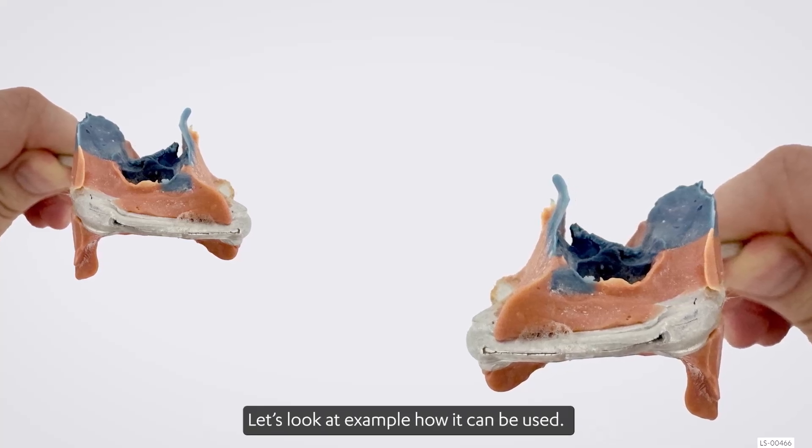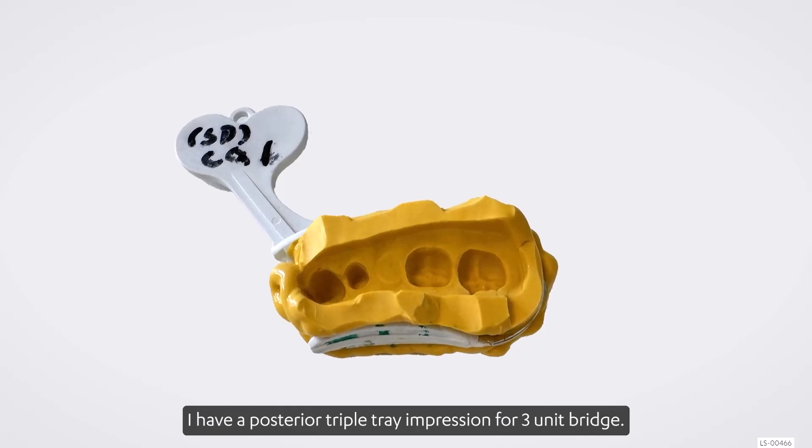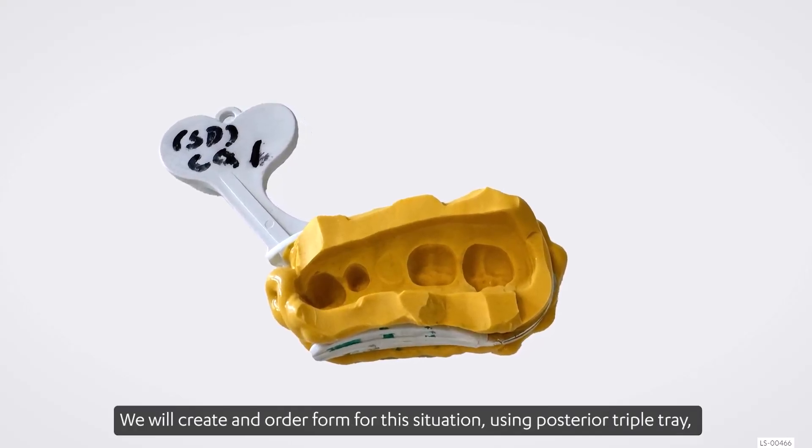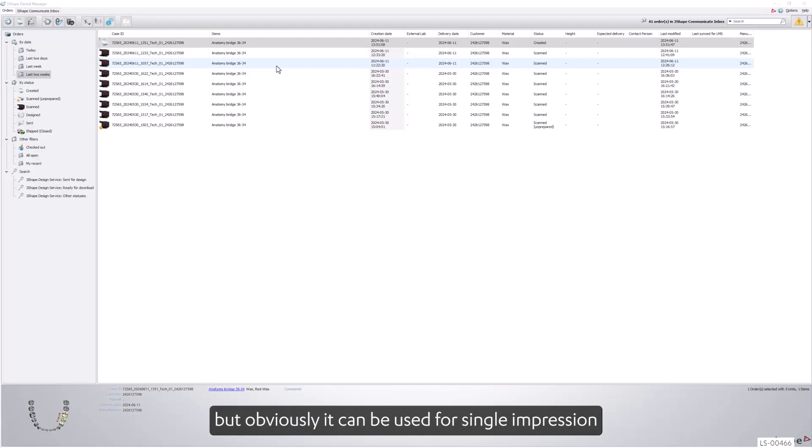Let's look at an example of how it can be used. I have a posterior triple tray impression for a three-unit bridge. We will create an order form for this situation using a posterior triple tray, but obviously it can be used for single impressions or individual trays with a bite.